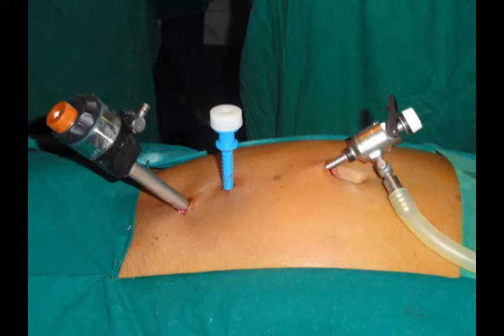Normally a 10 cm by 15 cm soft mesh is used, and the 10 mm port is for introduction of the mesh — this can be seen from above. The mesh is passed under vision, and that's another advantage: it doesn't get stuck on the way when you introduce it from the top blindly. That's the advantage.